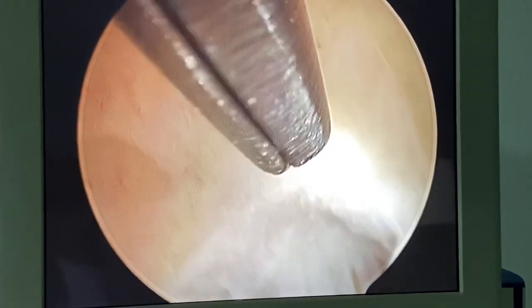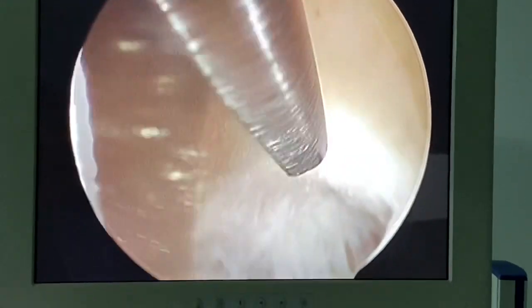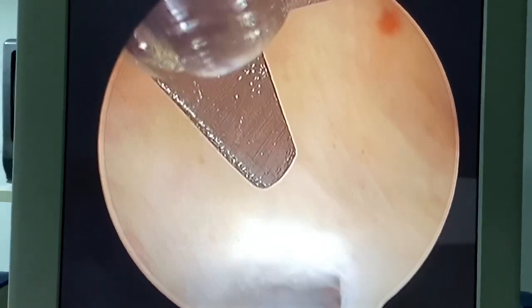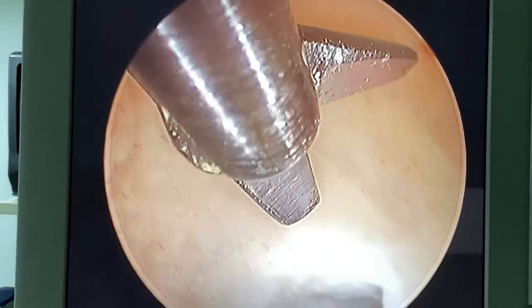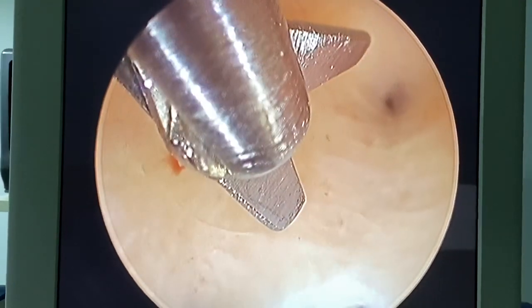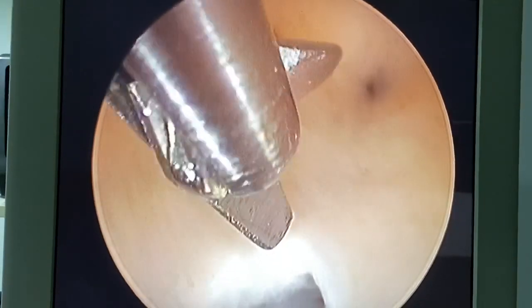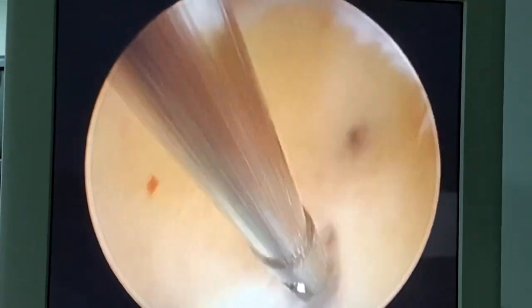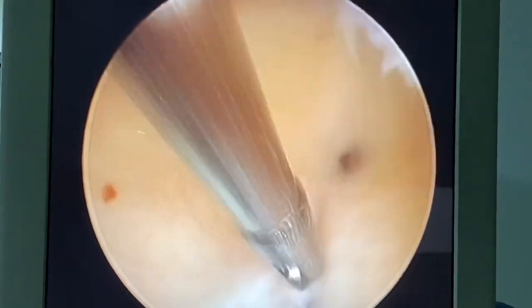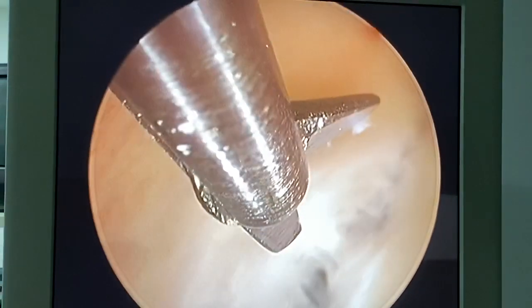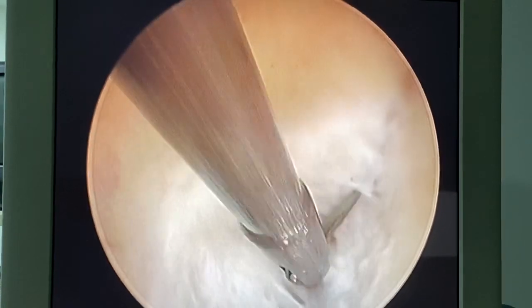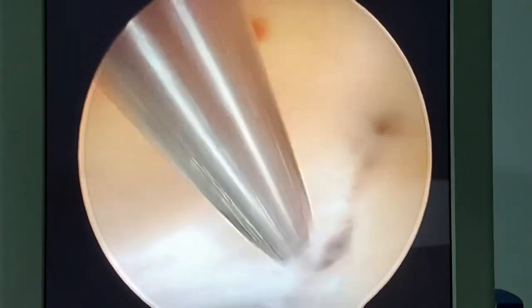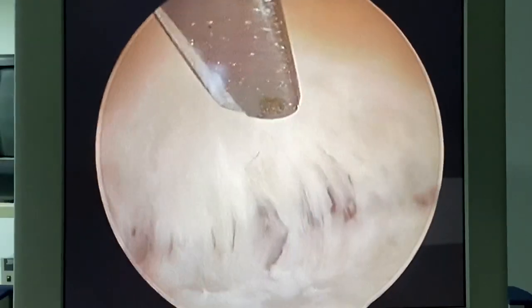Learn how to rotate the scissor to the other side — this is rotation. On the other side you cannot see the ostia. Rotate the camera and cut. These are the secret tips you won't find in a textbook; few people share them. Learn and do. Always be careful to adjust the focus.